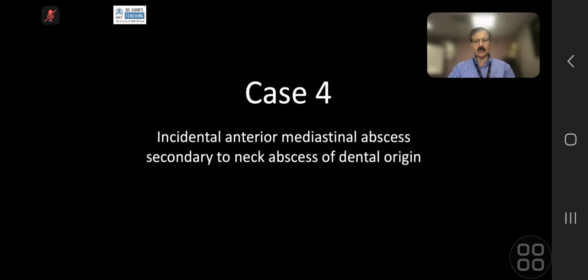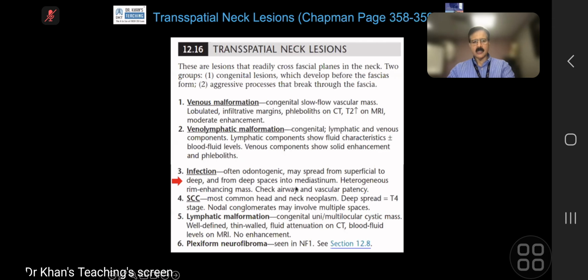This must be going on since ages, and with that, there was a secondary abscess extending to the mediastinum. Now, there are a lot of learning points, and this is the key case which I have selected today to do a bit of teaching on.